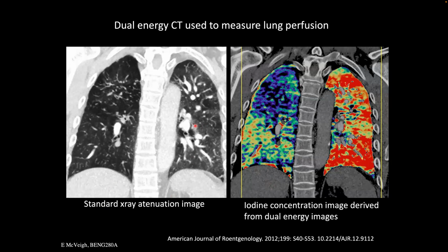So here's a CT of a standard CT acquisition, right? And you look, and there's an obvious difference, right? It's sort of nature produced people that are symmetric, principally symmetric down the middle for radiologists, right? So they can look at the left side and the right side, and if they're different, then you've got a problem.